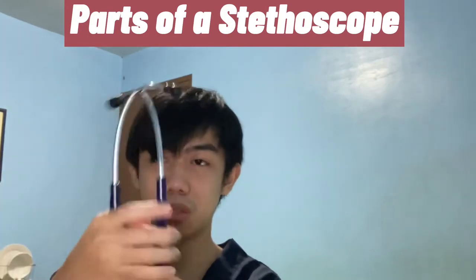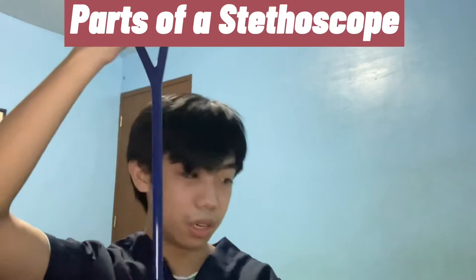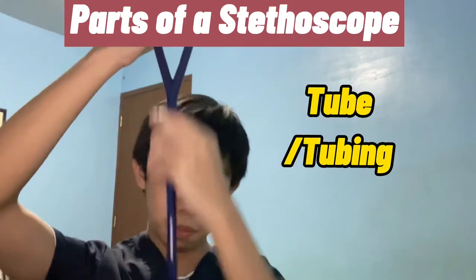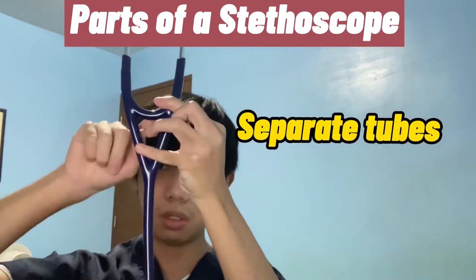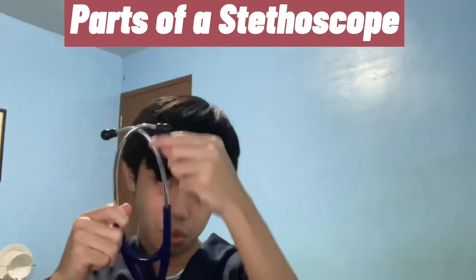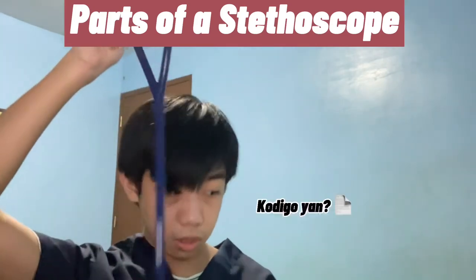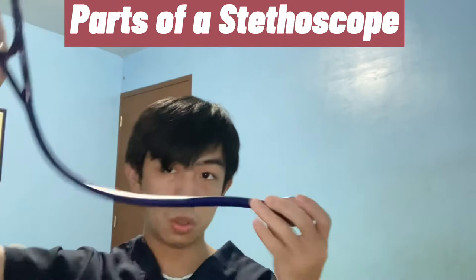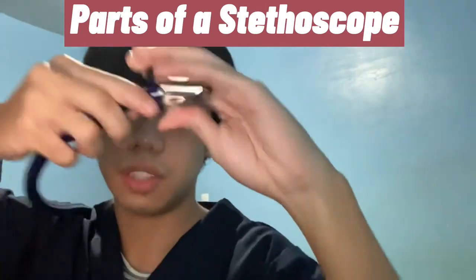This is the headset; these are the earpieces resembling earbuds. This part is called the tubing — as you can see, it has double tubing which separates here. It also has ear tubes, which are the metal parts. And of course, we have what we call the stem — the part that connects the tubing to the chest piece.